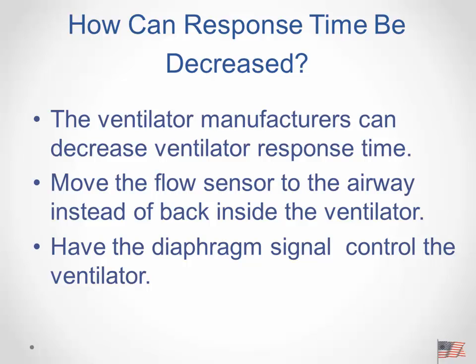Maybe move the flow sensor, instead of being inside the ventilator, put it right at the patient. Why? Good idea, bad idea. Flow sensors are basically very sensitive to humidity and secretions. So you defeat the purpose of having it at that point in time.